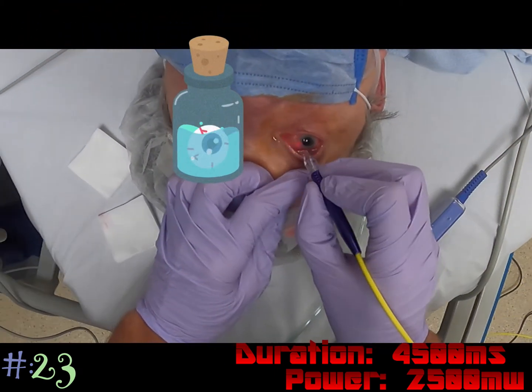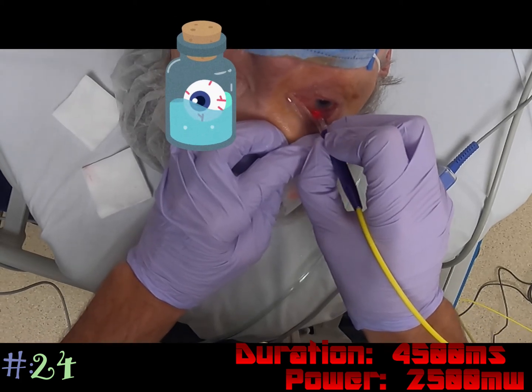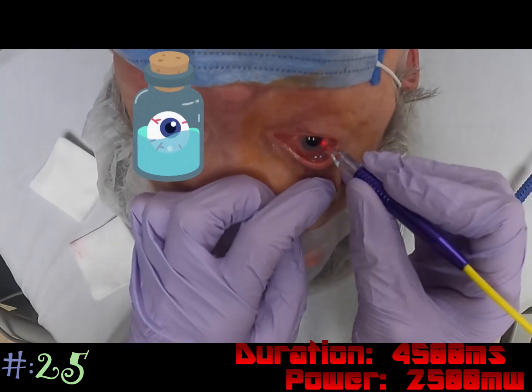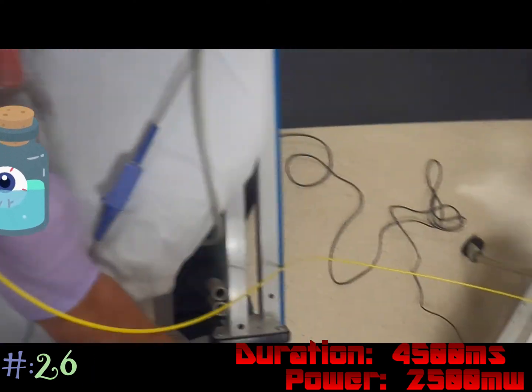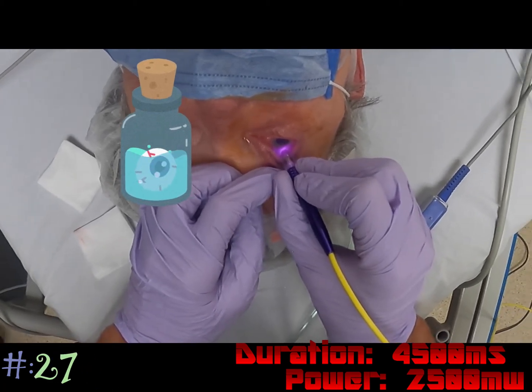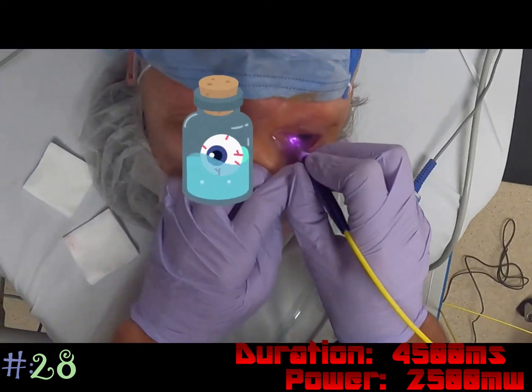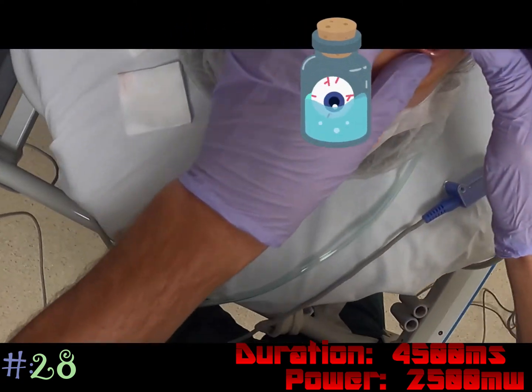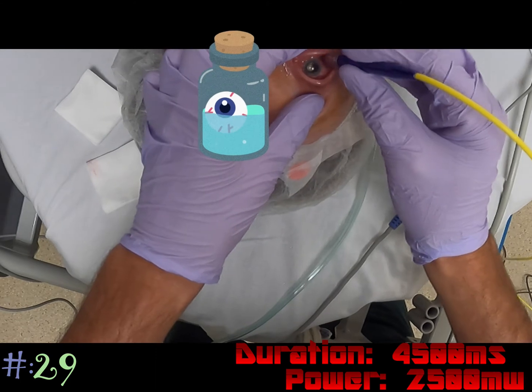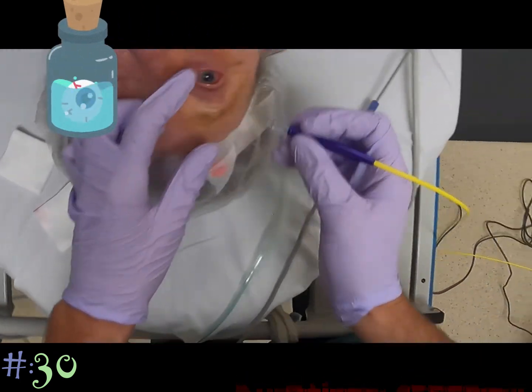We're at 23 spots, seven more to go — a little more posterior on this round. I'm trying to avoid the tube region up here; I don't want to cause any damage to that bleb. I just need to fit in two more spots to get my 30. And that's all 30.